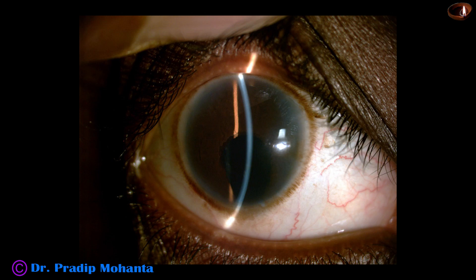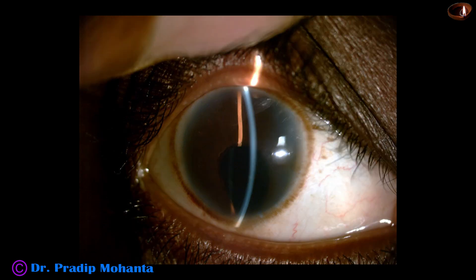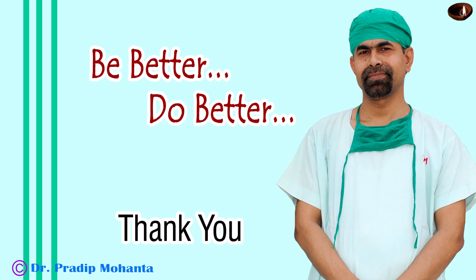See the post-op pictures: cornea is clear, anterior chamber is quiet, and the postoperative refraction is minus 2 cylindrical — residual cylindrical error. The unaided vision is 6/36 and the patient is very happy. Thank you very much for your attention. Hope this video will help you in managing such cases. Be a great surgeon and serve your patients with love, respect, empathy, and great surgical competence.